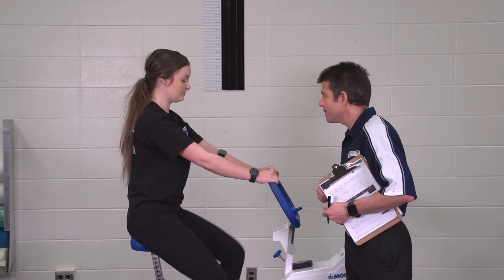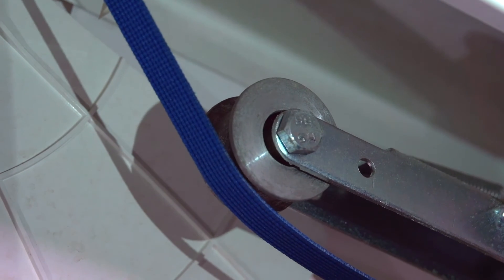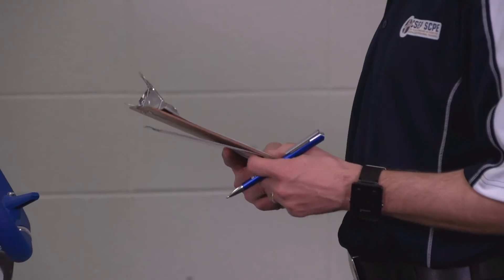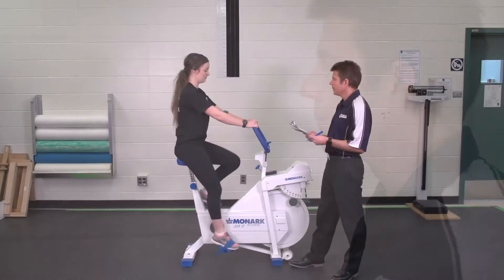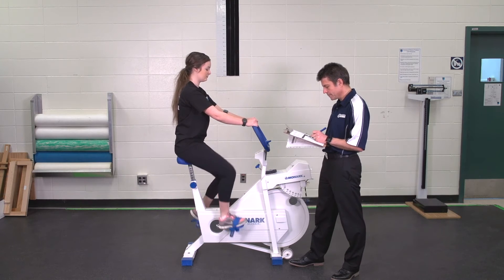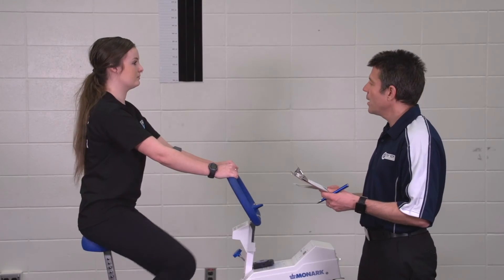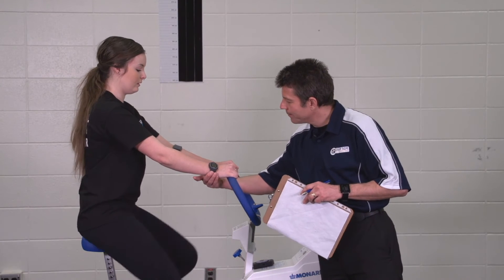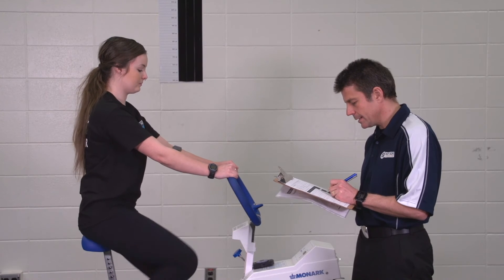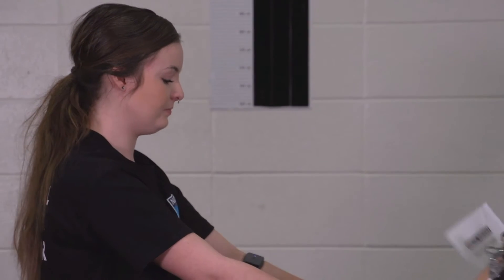I want you to keep pedaling at that 50 RPM while I adjust the bike. Alara, we're at minute one — I'll check your heart rate. Okay, we're at minute two — I'm going to check your heart rate again. We're coming up on minute three — I'm going to check your heart rate one more time. And again it is in steady state. How difficult do you find this? Fourteen.